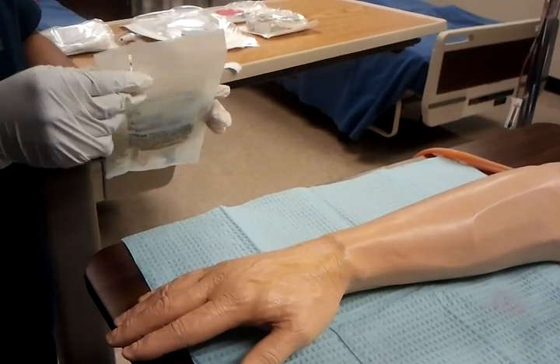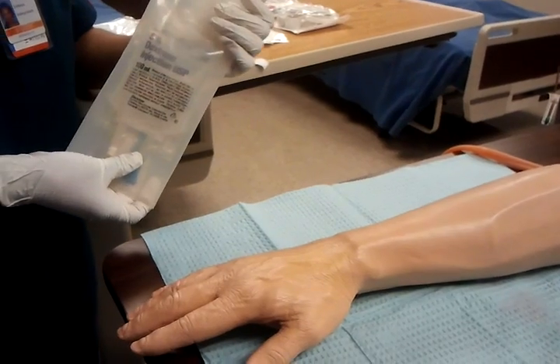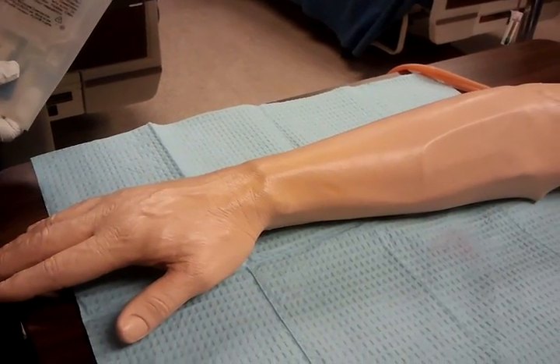Next step would be to assess the client's previous or perceived experience with IV therapy and arm placement preference. You'll ask them, have you ever had an IV before? Where did they usually get you?